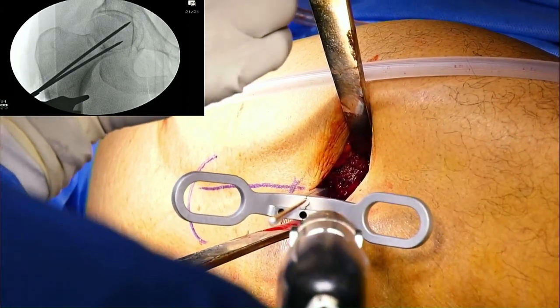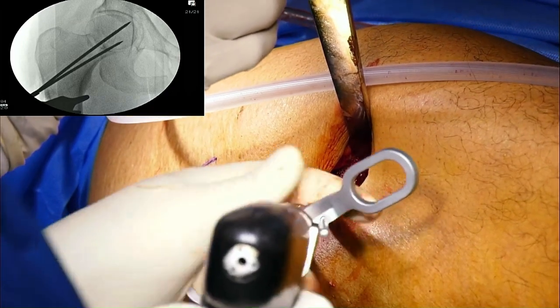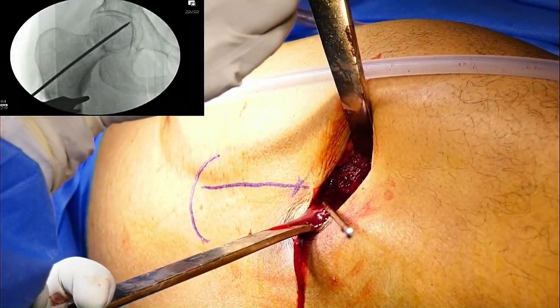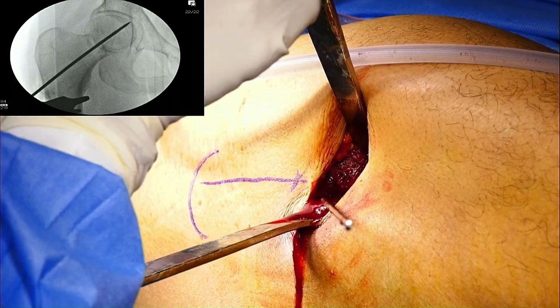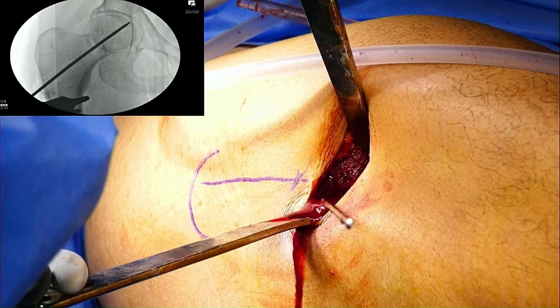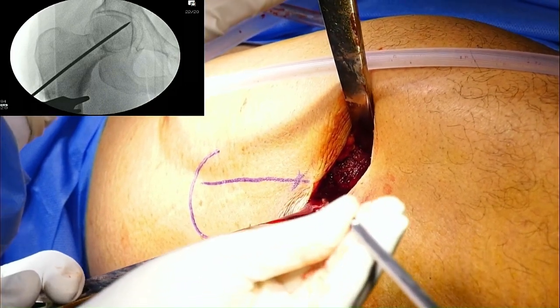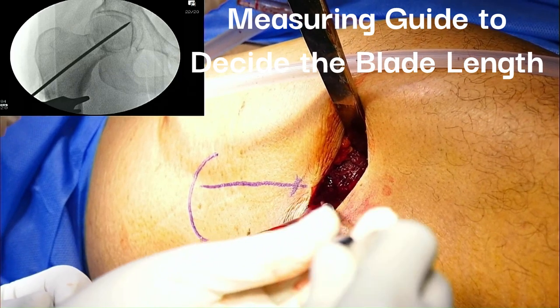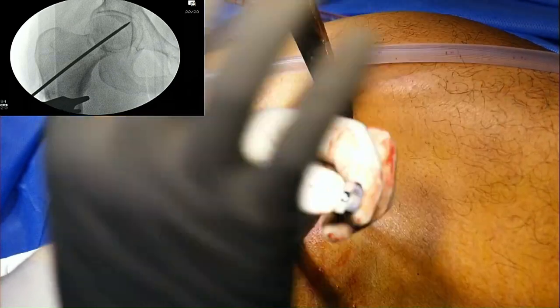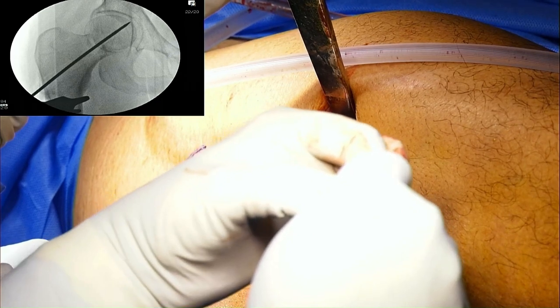I already drilled it, so I will not remove this and I'll just measure five millimeter less. Shoot and save — this is the final AP. Lateral also shoot and save for record. This is the measurement instrument — I pass it over the guide wire, which says 110mm. I know I have gone to subchondrally and will almost pierce the joint, so I'll reduce 10mm — it will be 100. So 95 or 100 will be better.